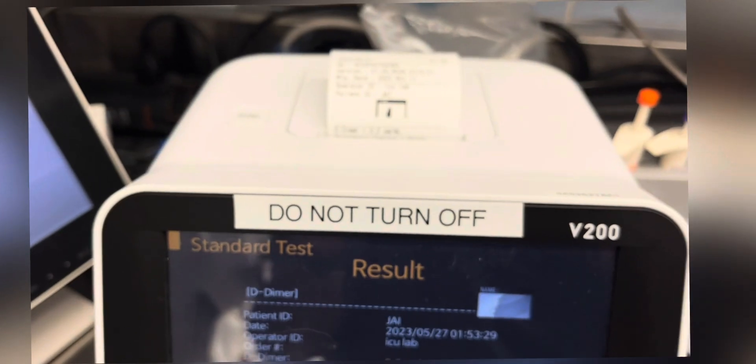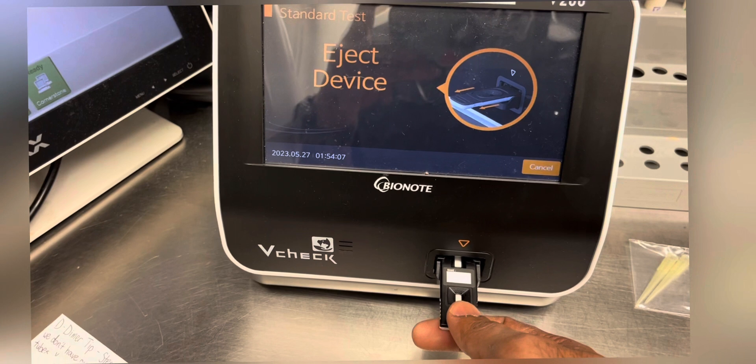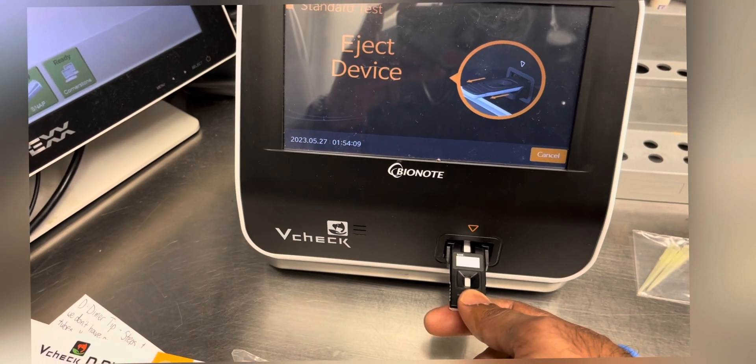After the results are printed, the last step is to eject the cartridge out of the machine. This is the end of the procedure.